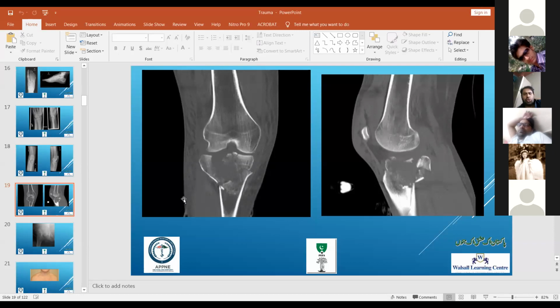This patient had a ring fixator with olives to reduce the fracture. An extra plate was put in and bone grafted. This person's knee is never going to be normal. So, you know, you have to make the best of the worst situations.